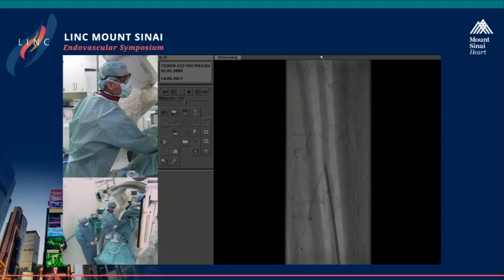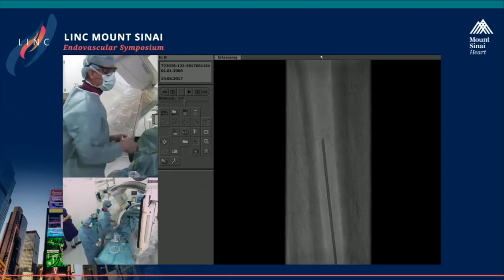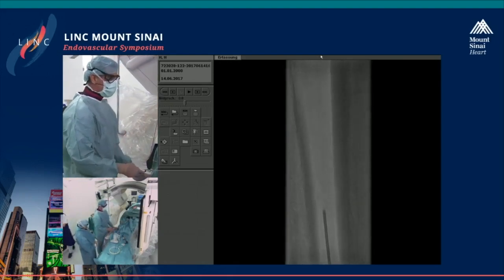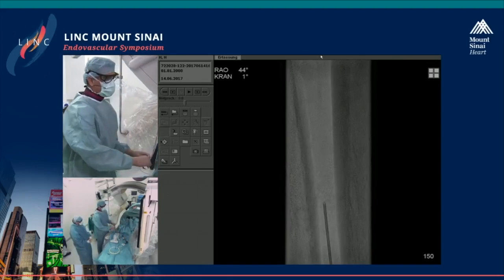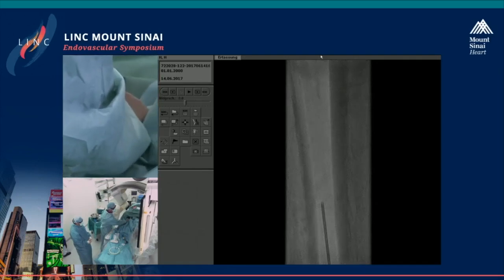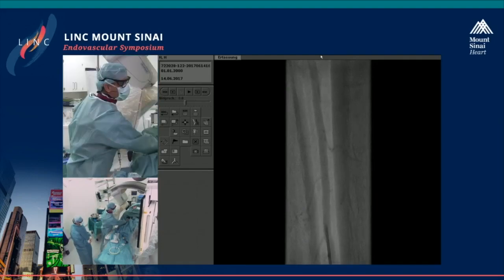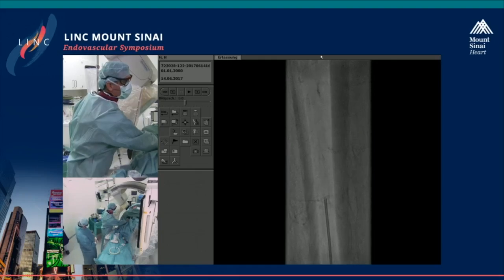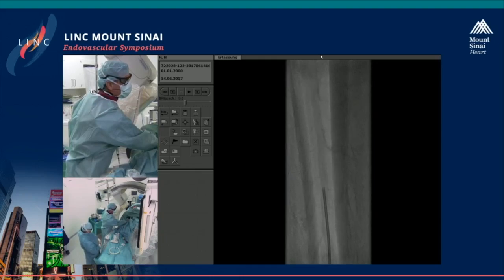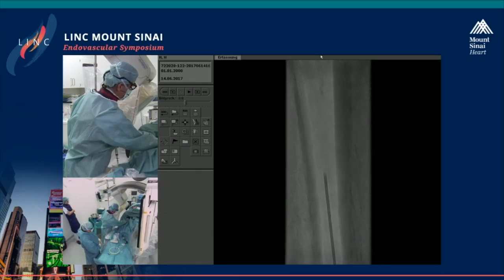So I inject contrast while I also go down here. I'm not sure whether this is a good direction. The needle really should be on top of the artery, and during the puncturing I should not really try to take the artery to another course. Yeah, I've pulled it a little back and now I go here. Is there something? No. Just a moment. No? No. Oh, it's relatively deep, huh?